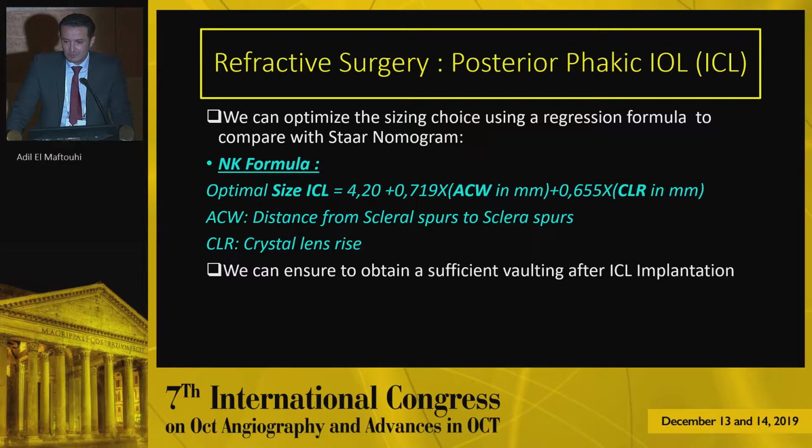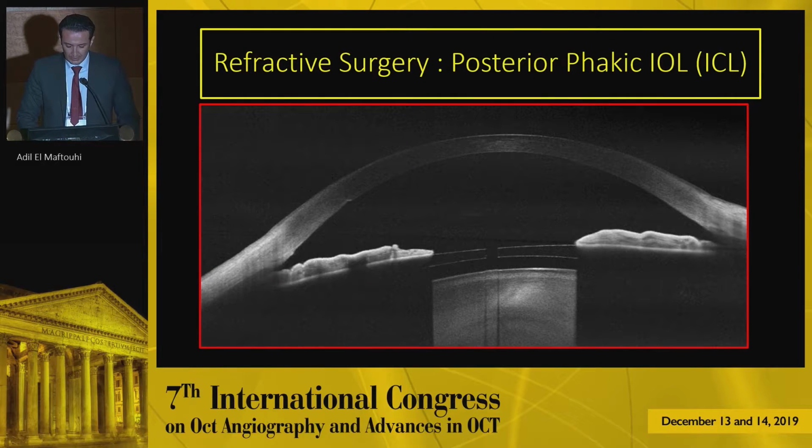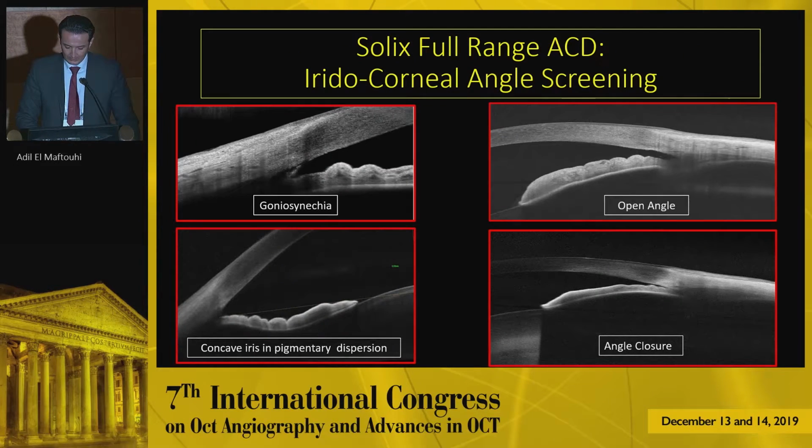You can find a specific website made by Dan Reinstein, ICL-sizing.com, to have this formula. And you can obtain sufficient vaulting after ICL implantation, like in this case. And you can easily measure this distance to the scleral spurs and check the vaulting after phakic IOL.